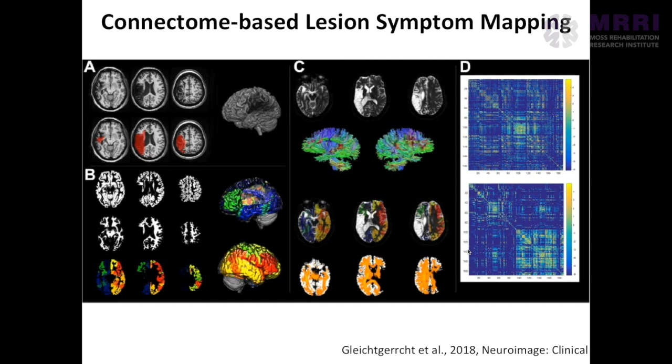In terms of connectome lesion symptom mapping, you can use any kind of matrix of connectivity data that you have. So in this case, you can use probabilistic tractography as one form of diffusion tensor imaging. You can use resting state functional connectivity. It really is quite flexible. What I'm going to talk about from some of the work I've done more recently is using structural connectivity or disconnection on the basis of stroke lesions, okay? So that is represented here in this approach.